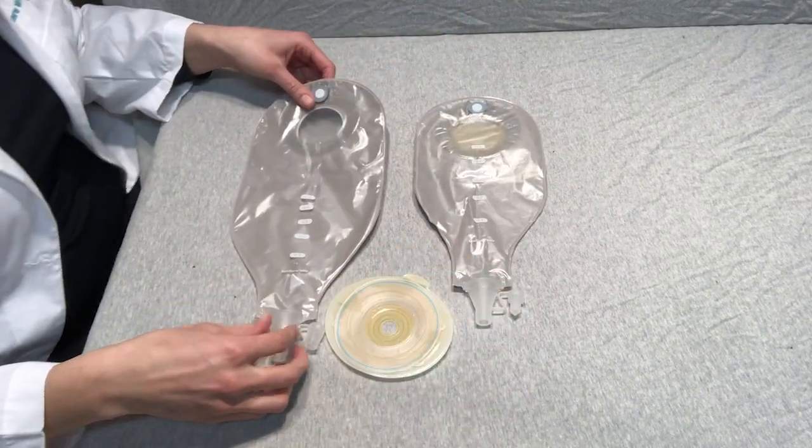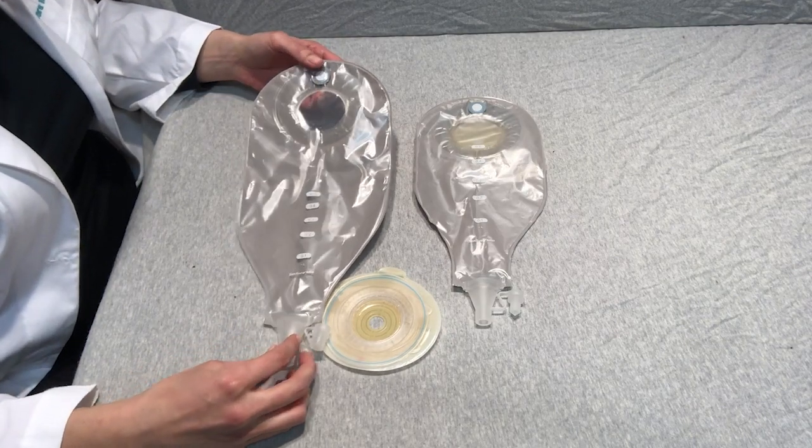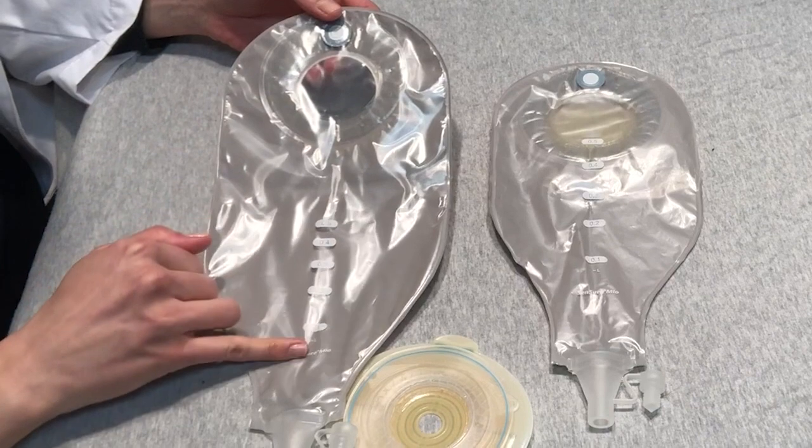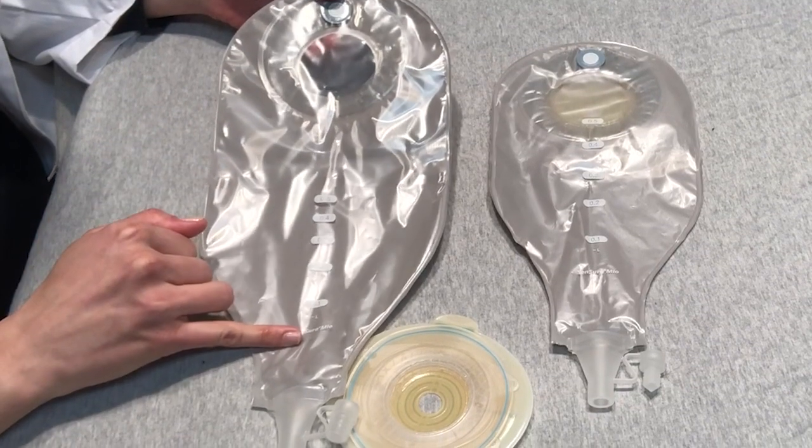This particular pouch is our two-piece high output flex. Same features on this pouch. We have the filter here, visual cue as well to help with measuring.